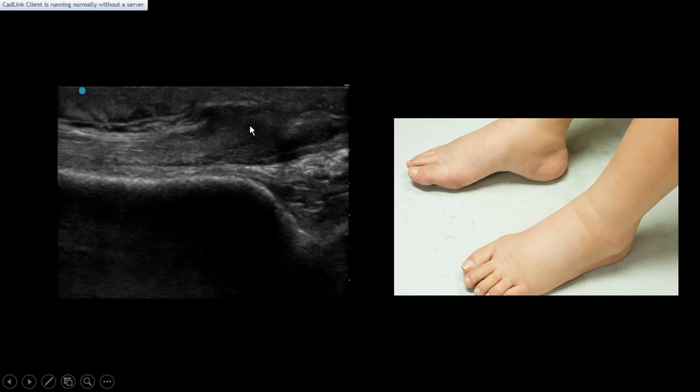So in her case, it was not visible, the ankles were symmetrical, and the stump was not palpable. As you can see, in the subcutaneous layer there is a lot of edema, and because of that, it was not obvious unless you do imaging of the ankle.